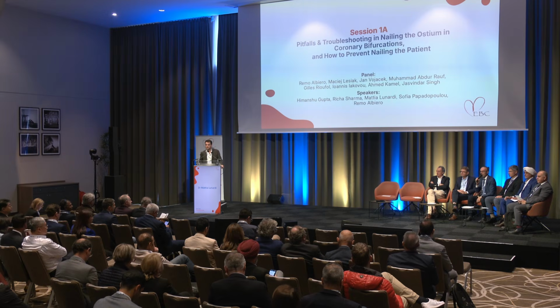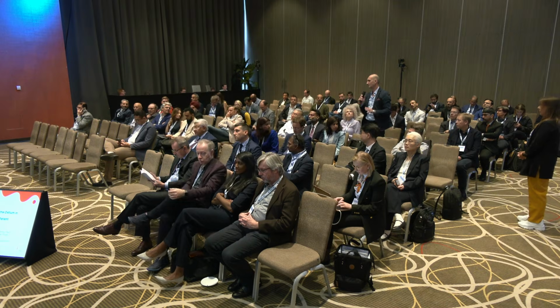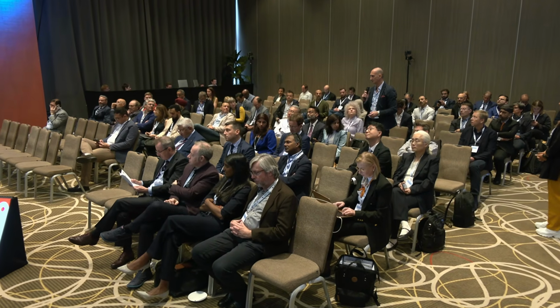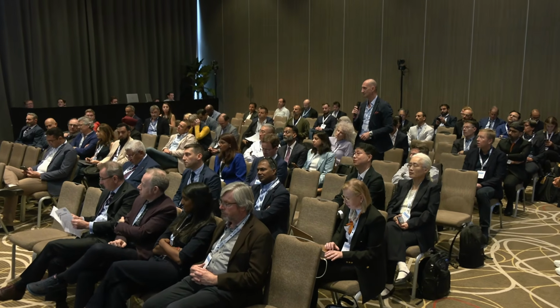There is another question. I've never done it before, but I'm reading about it since my beginning in interventional cardiology. What about the SCABO technique? The SABO technique? Yes, I'll show you. No, it's not recommended.